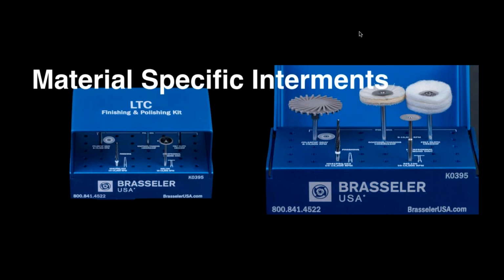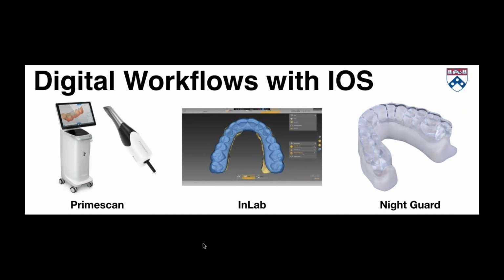Whether it's zirconia, hybrid ceramic, or PMMA, we want to have the best surface with our selected materials, okay? VITA provides a nice polishing kit for Enamic and for Suprinity, and I think that's the way to go. Make sure we have a specific set for each of the materials that we use, okay? And also understand that all our restorations require maintenance.